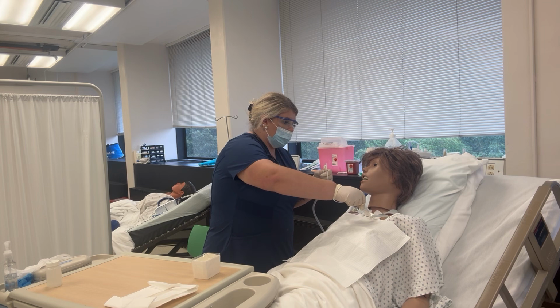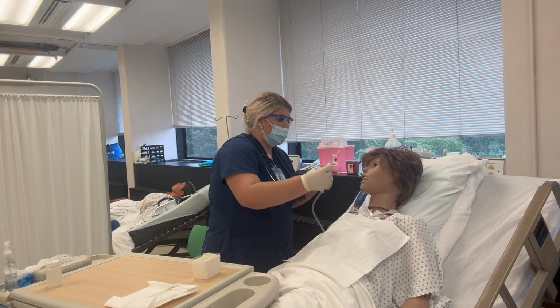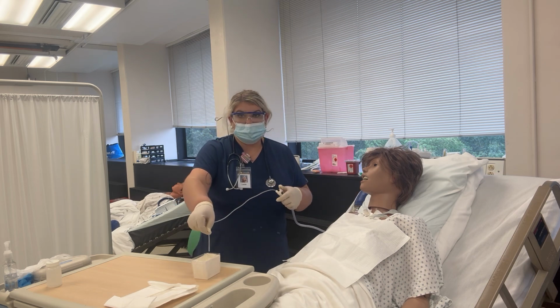And then when you're pulling out, you want to put your thumb over top to make the intermittent suction, going back and forth, until you've removed the catheter. Then we want to clean.